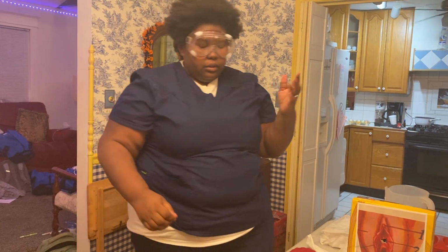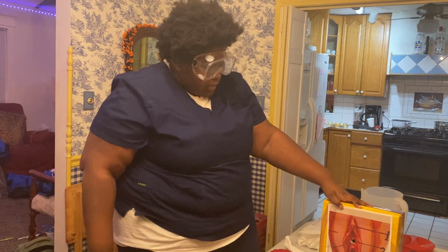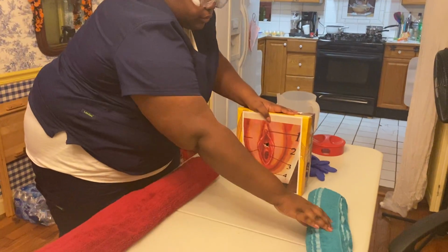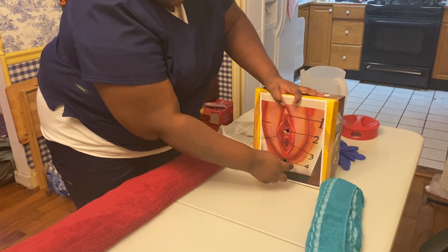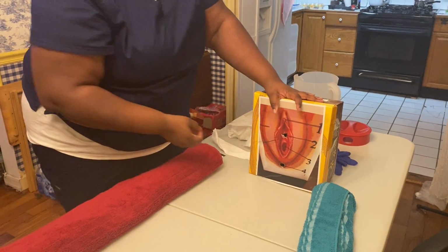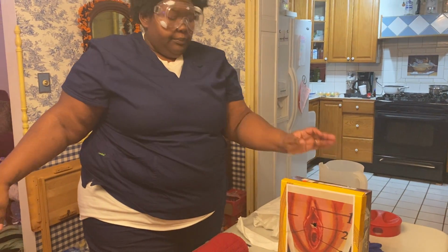After that, I will put on my gloves. Next, I will perform pericare on my patient. I will position my patient dorsal recumbent, and then I will verbalize. I'll wear gloves. I will close the labia, and I will clean this side, throw away. Then I will go this side, and then throw away. Then I will open the labia, go right down the middle, and then throw it away.